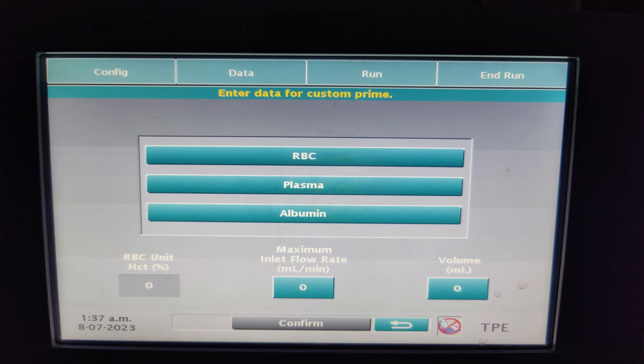Based on what custom priming we are doing, the fluid type has to be selected. If it is RBC, we have to enter the RBC unit hematocrit. For any fluid, we have to enter the inlet flow rate and the volume of fluid we are willing to provide for custom prime.